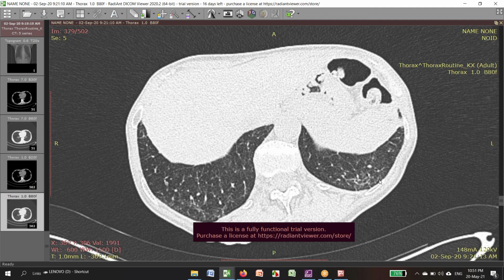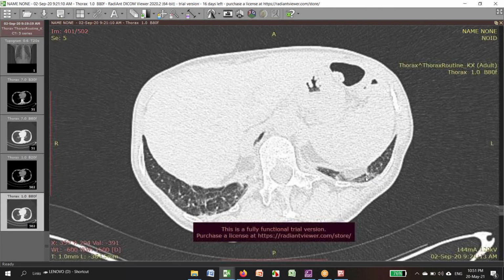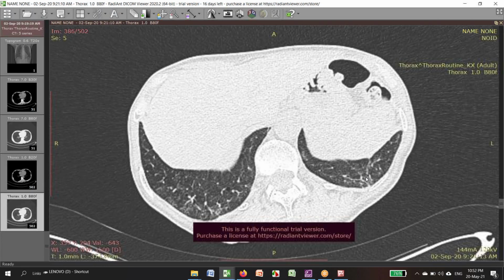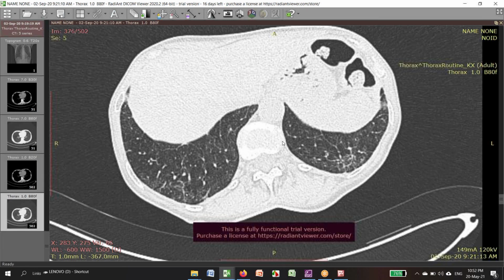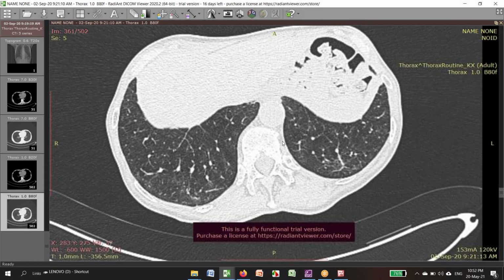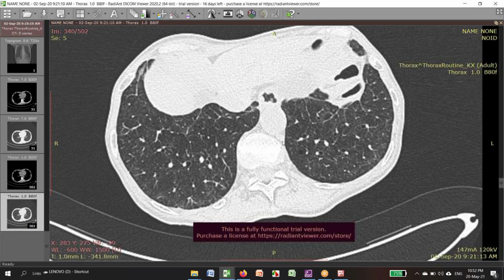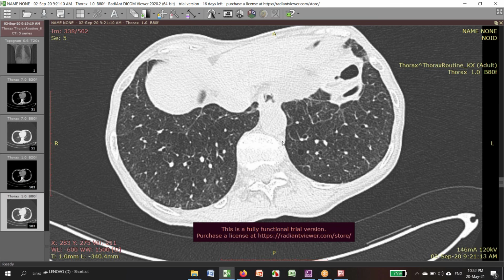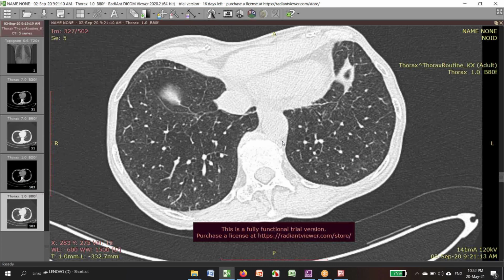Right, but your point about calling it bronchial dilation, I think, is very important, and that's something I've changed in my practice over the last several years, as I've come to recognize it more and more. I'm a lot more cautious about using the term traction bronchiectasis unless there's unequivocal fibrosis, because it does imply it's not reversible. And your case nicely illustrates the point that not all dilated airways are irreversibly dilated.